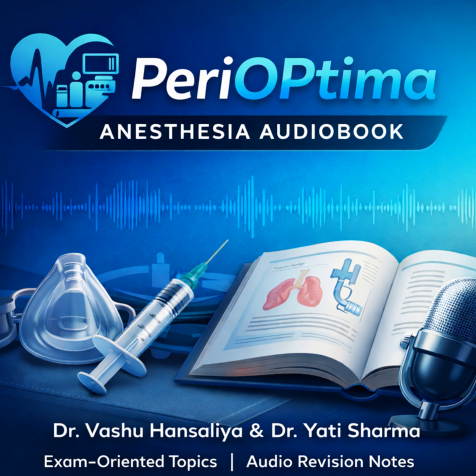Also, don't forget PEEP, positive end-expiratory pressure. In patients with COPD or asthma, we have to watch out for auto-PEEP, air trapping. You can see that on the flow-time scalar, right? Right. The expiratory flow doesn't return to 0 before the next breath starts. Precisely. That trapped gas increases intrathoracic pressure and can cause hypotension or even cardiac arrest if it builds up enough.